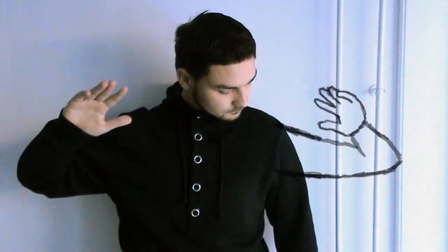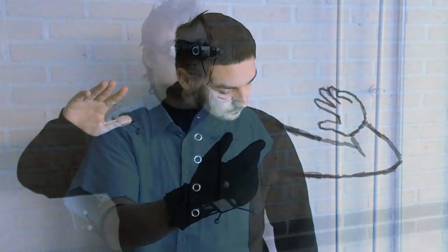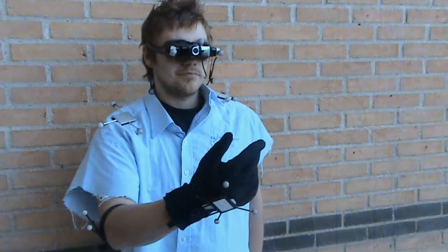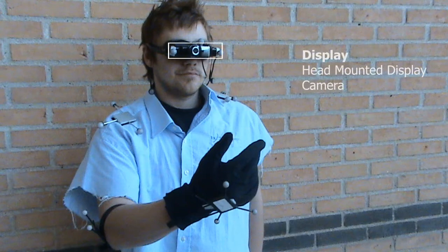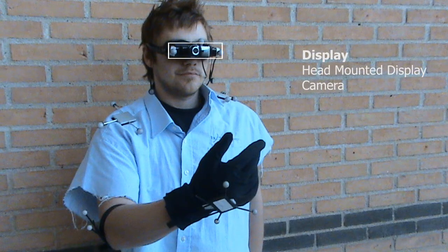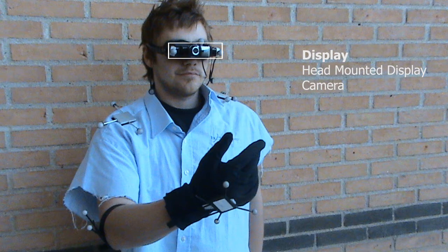To examine this claim, a treatment based on augmented reality was created. A head-mounted display and camera are placed on the subject's head to display the real world, which for the user is like viewing it through a pair of glasses.